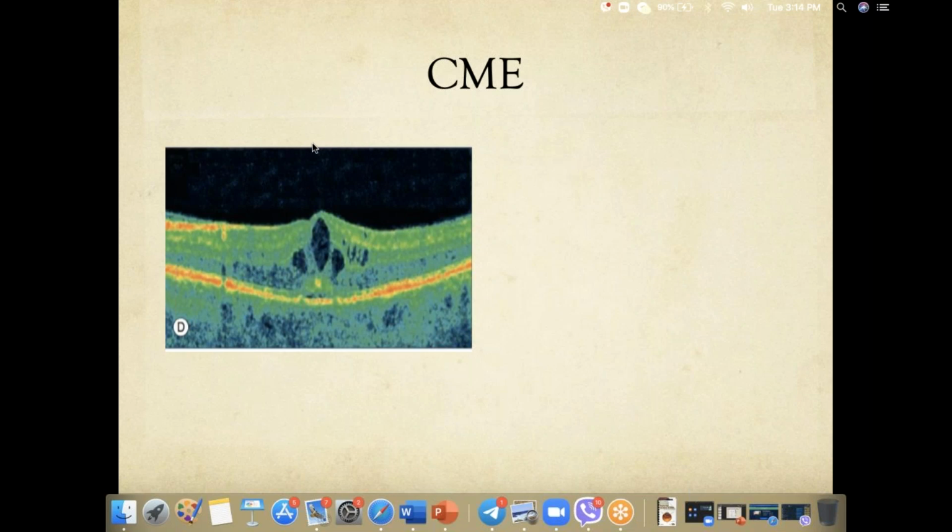Because in this patient, after you put the injection, the edema subsides, visual acuity gains, and when the fovea shrinks, then this patient will actually have a better visual acuity. When they have a better visual acuity, the foveolar plaque right in the center and the loss of the photoreceptor layer right in the center start becoming more evident to the patient.